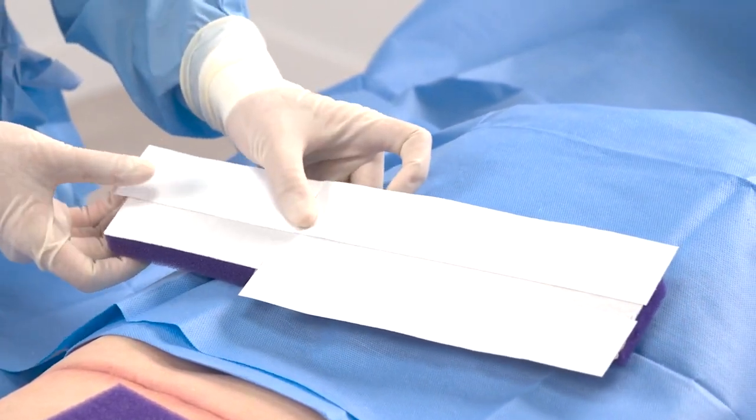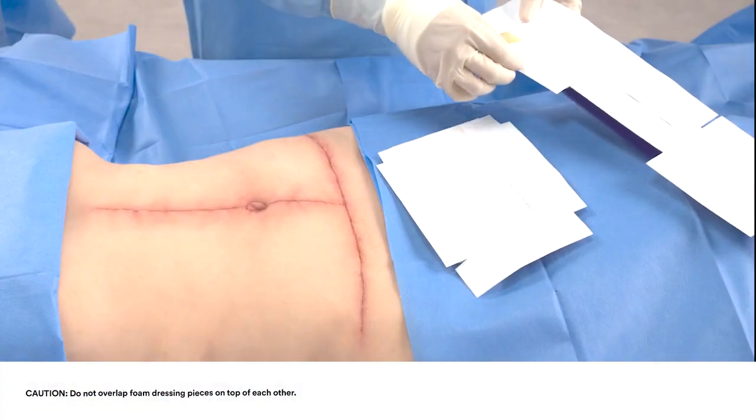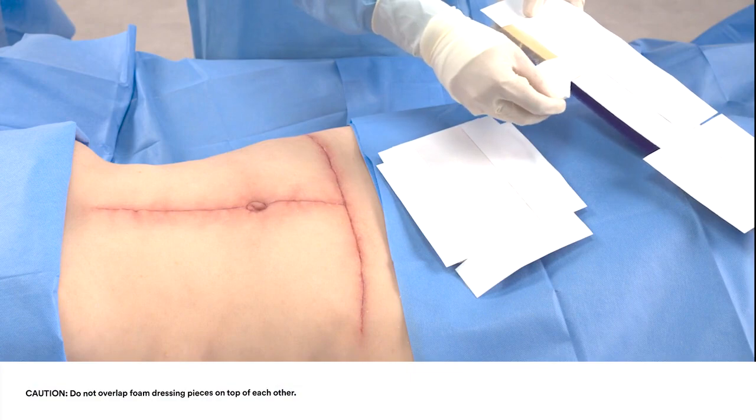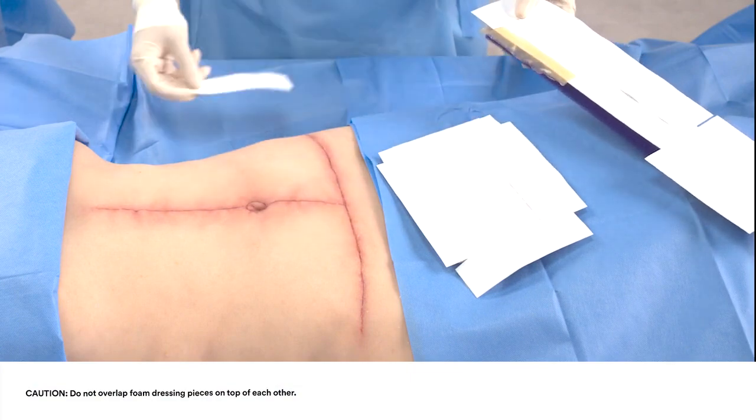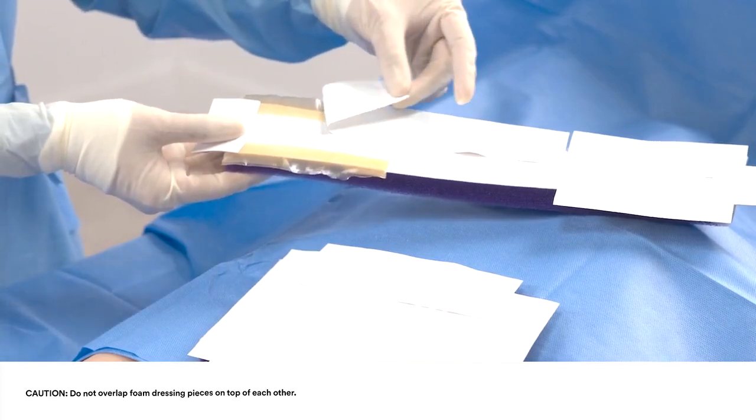Sealing strips should have equal overlap on both foam dressing pieces. Remove one of the liners from the sealing strip. Sealing strips are tacky on both sides. Place the sealing strip on the border of the foam dressing, creating a continuous seal.